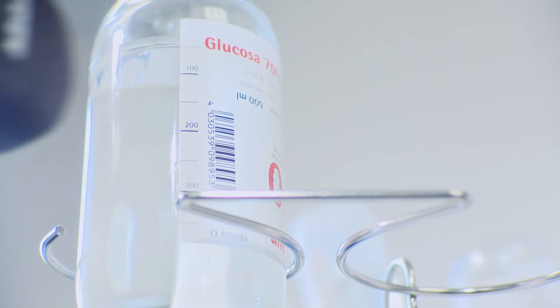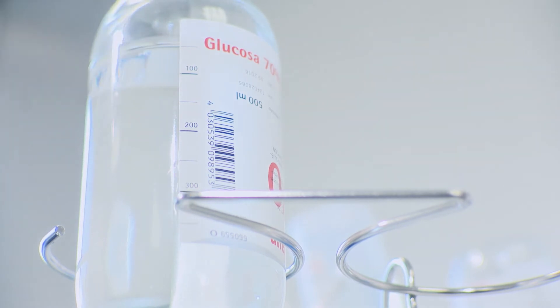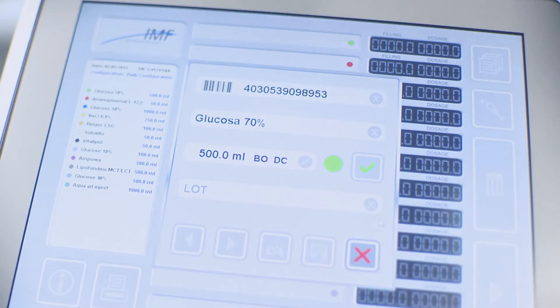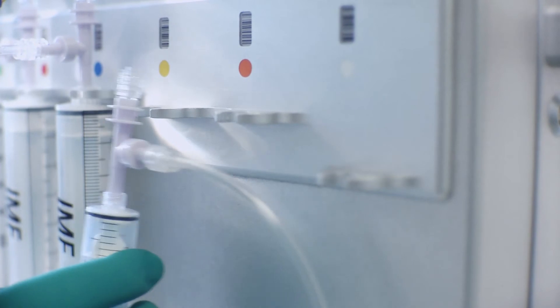Use the barcode reader to scan the port barcode on the compounder followed by the container barcode. If performed correctly, the compounder will automatically display the next ingredient to connect. This will verify the right container is attached to the corresponding line.